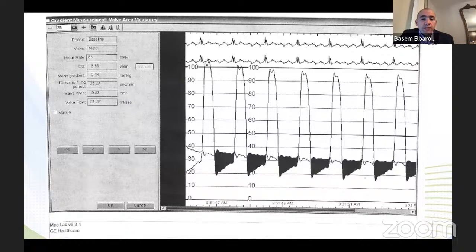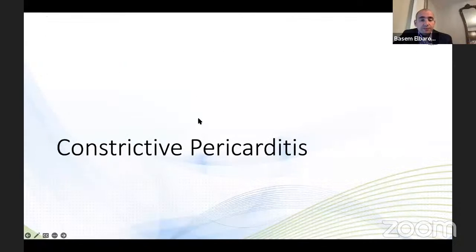The surgeon will need a coronary angiogram anyways. So by adding a right heart cath, we get more information to confirm that we're doing the right thing, or if we're not sure, the other way around. So that's still some utility there. And there are still cases where we're not 100% sure. Not common, but we do see them from time to time.